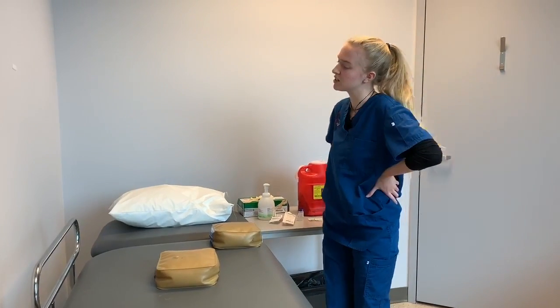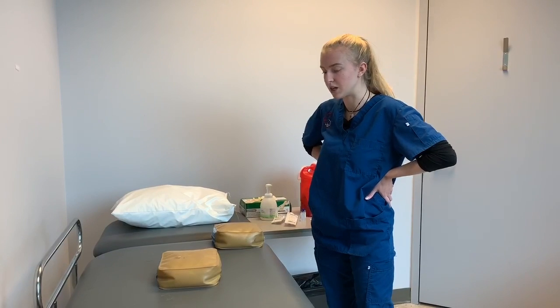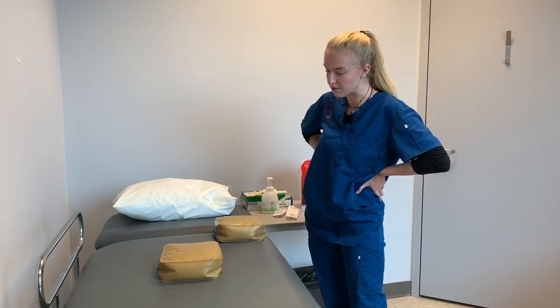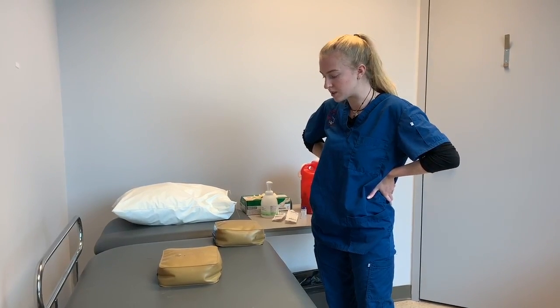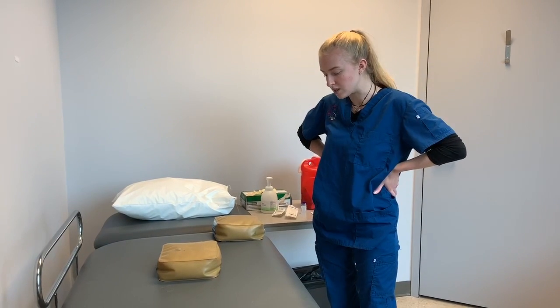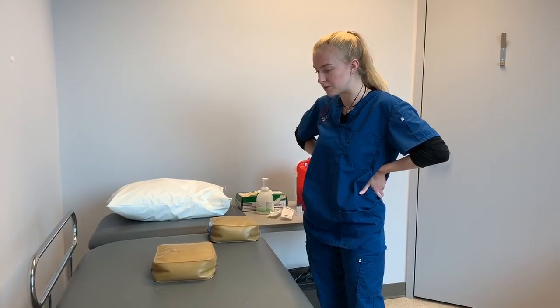Okay, Mr. Mancini, so today what I'm going to be doing is first I'm going to give you a subcutaneous injection of 5,000 units of heparin. This is given every 12 hours, and your last dose was given 12 hours ago. And then I'm going to give you an intramuscular injection of Haldol. It's going to be 1 milligram. It's given every 4 hours, and your last dose was 4 hours ago.